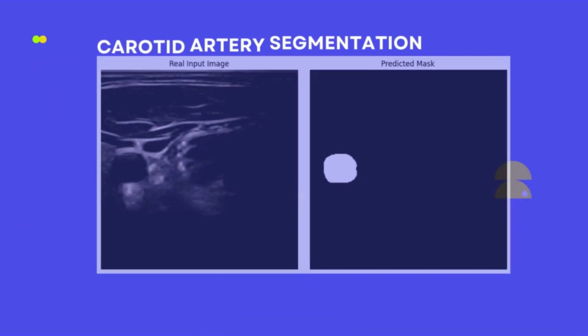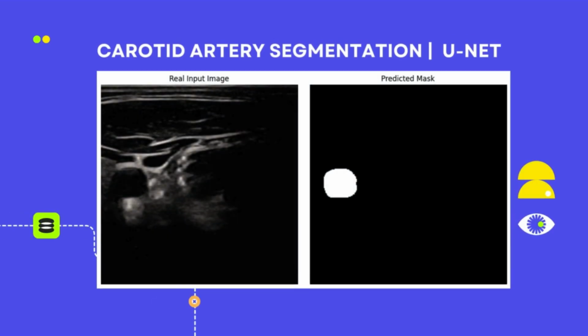In this video, we're going to be creating a carotid segmentation project using the UNET architecture. So without wasting time, let us start our tutorial right now.